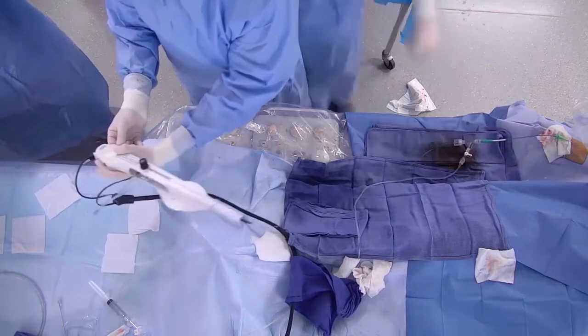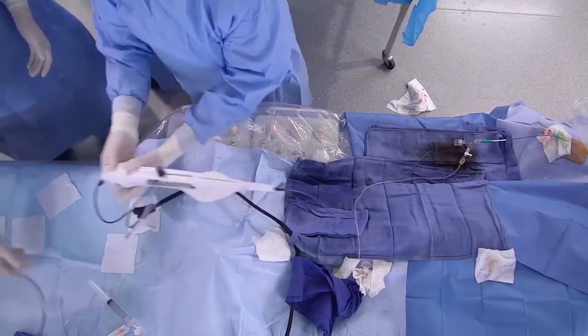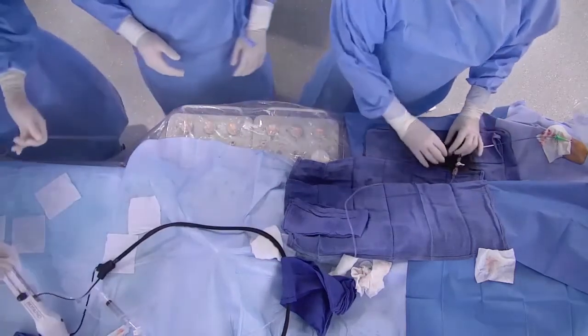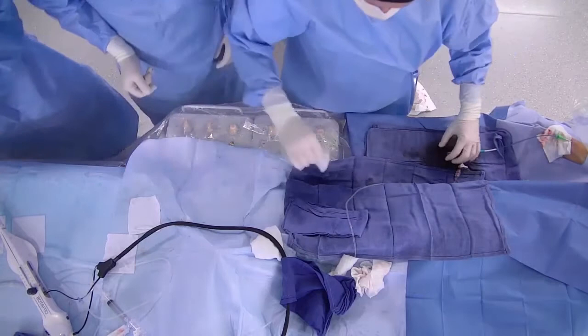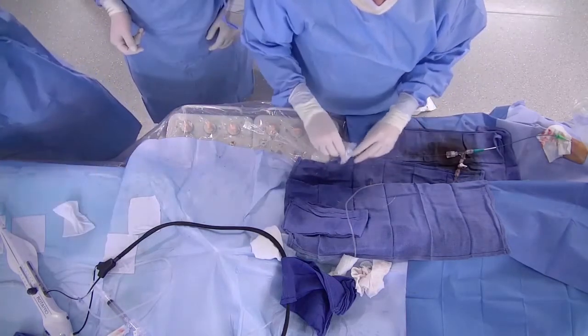Out. Okay, everything is out. I don't know if you noticed, but so far we didn't use any single drop of contrast. Everything has been done very properly. And then I will place my workhorse wire inside the LAD.